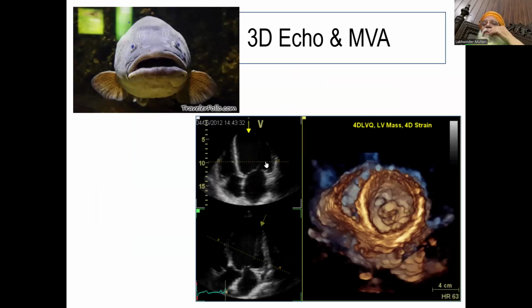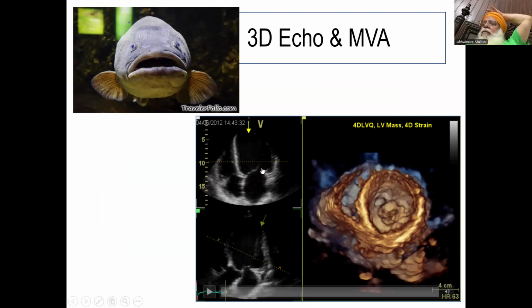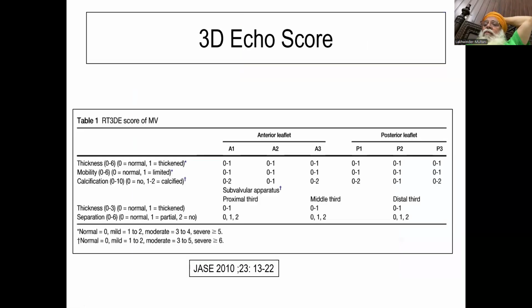Yes, correct. So what happens? We do not have a mitral valve area with us, but we have the mitral valve VTI. So if I divide the LVOT area times VTI by the mitral valve VTI, what I'll get is the mitral valve area. Yes. Okay. Thank you.